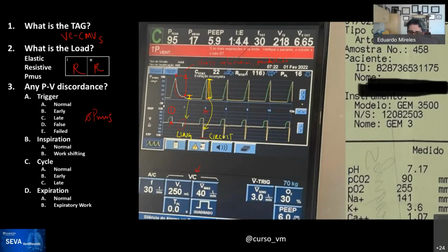This is a common issue. You can see that the patient here has enough oxygen to donate to another country. The CO2 is elevated, but the pH actually is not that bad. In this group of patients, we tolerate a pH around 7.15 and above. So the question is, how do you improve or optimize gas exchange in this patient?